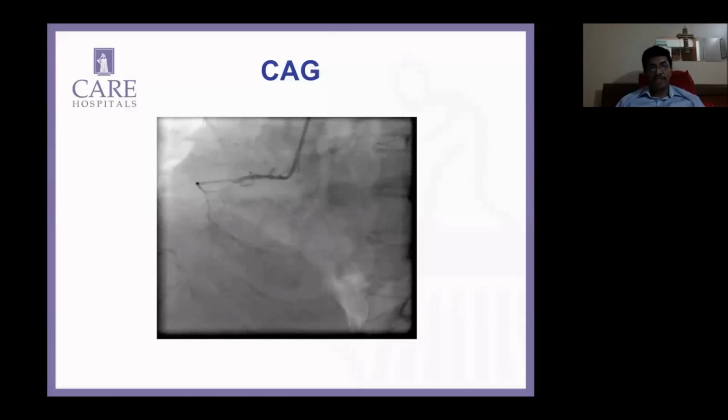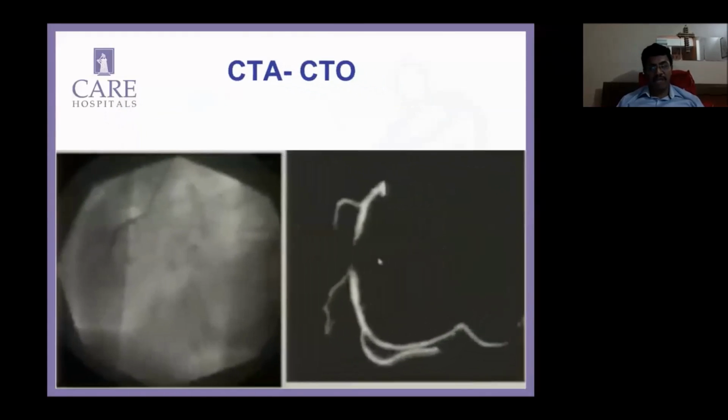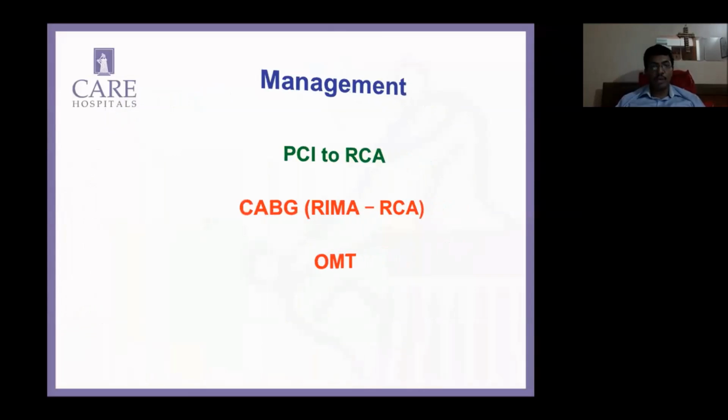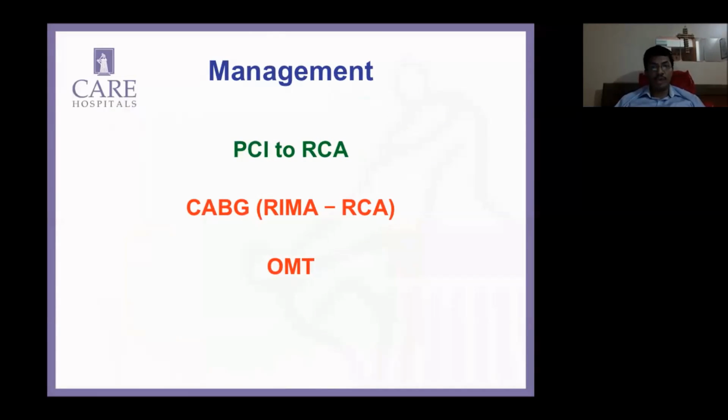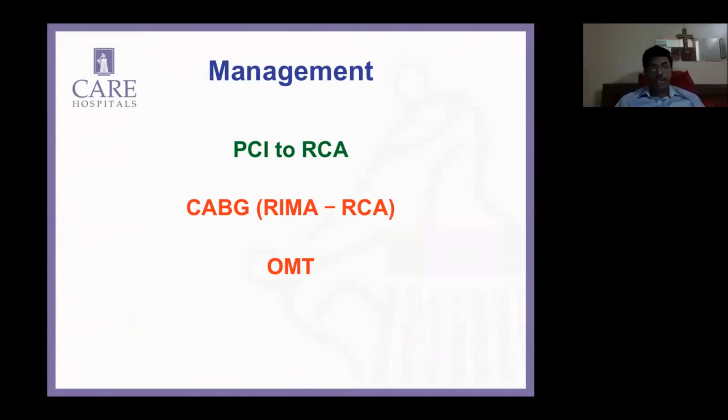In fact, I'm getting a number of referrals now in total occluded vessels. I call them reverse referrals, especially for the LAD, but also for some other vessels, where with good software use and a little bit of iterative reconstruction, we can really piece together the distal vessel fairly well.